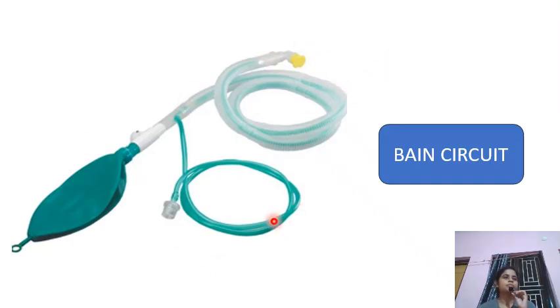This Bain circuit is mainly used in anesthesia, but for ventilating patients in the ICUs or in the emergency room, the Bain circuit can also be used.